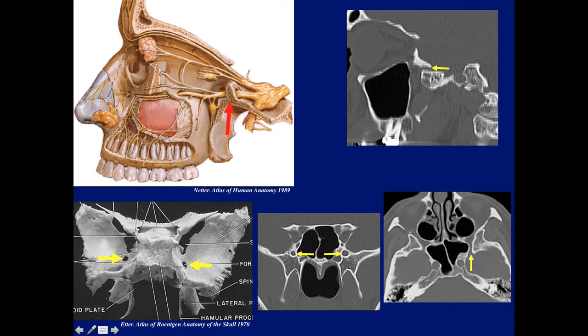Now we can identify the foramen rotundum, which we can see on the specimen here. Again: clinoid, superior orbital fissure, foramen rotundum — and we can see it best on the coronal CT image. Here's the foramen rotundum on each side. It's still hard to find its location on the sagittal and axial images, but here it is on the axial image, and here it is on the reformatted sagittal — foramen rotundum, where the second division of the trigeminal goes through.